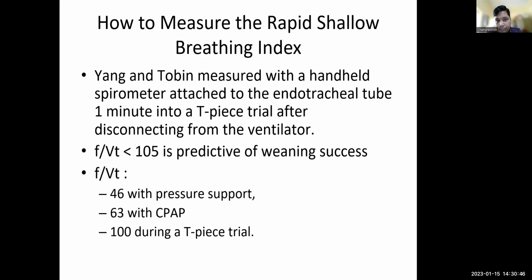And they measured the tidal volume in this handheld spirometer, and also they calculated the respiratory rate of this patient. And they divided the respiratory rate by the tidal volume generated. The tidal volume, remember, here will be in liters, not in milliliters, but in liters. And if the number is less than 105, that predicts weaning success.